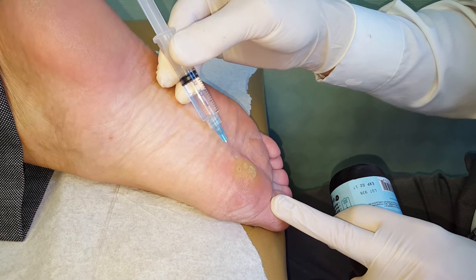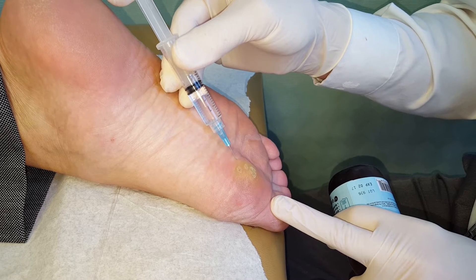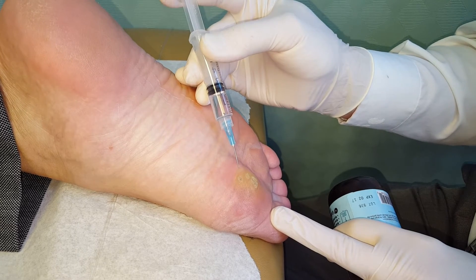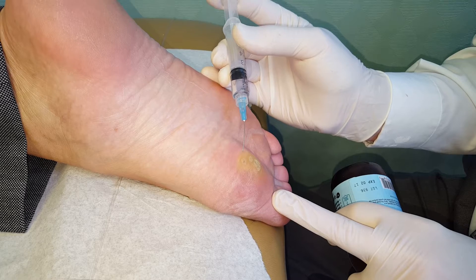We're just going to draw a wheel. This is half percent Marcaine Plain. We're going to put in about three to five cc's in here slowly, going to move the needle underneath each of the warts. How are you doing? Doing okay?